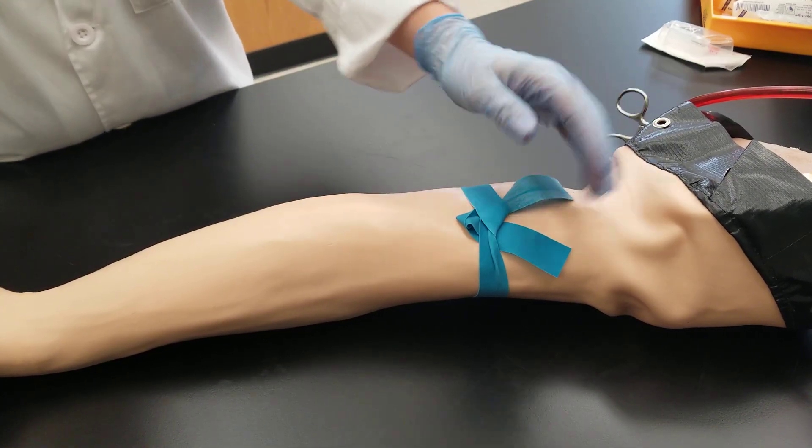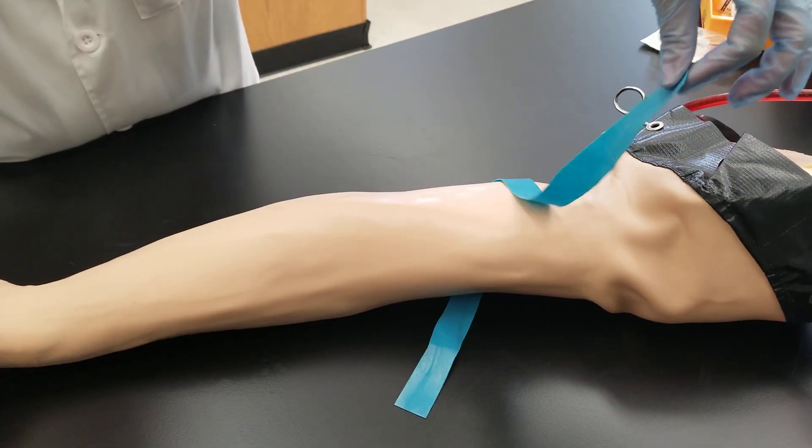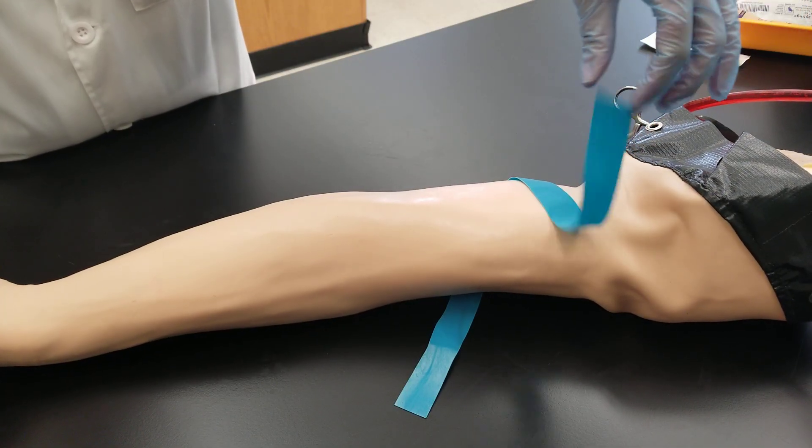The tails are up facing towards the patient's shoulder, and when you release it, it automatically falls away.